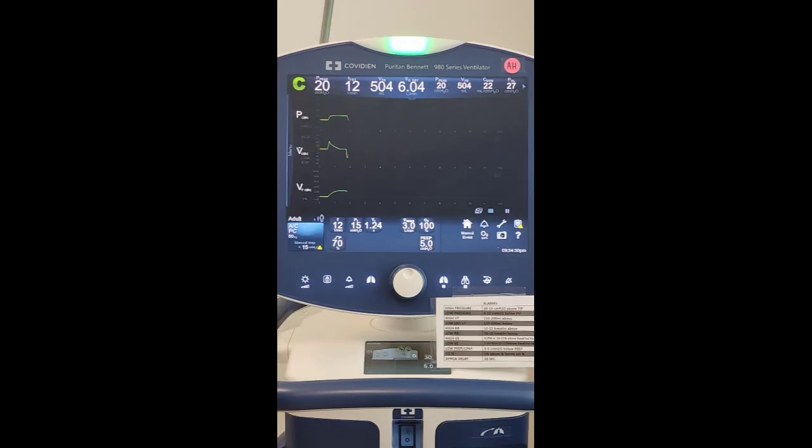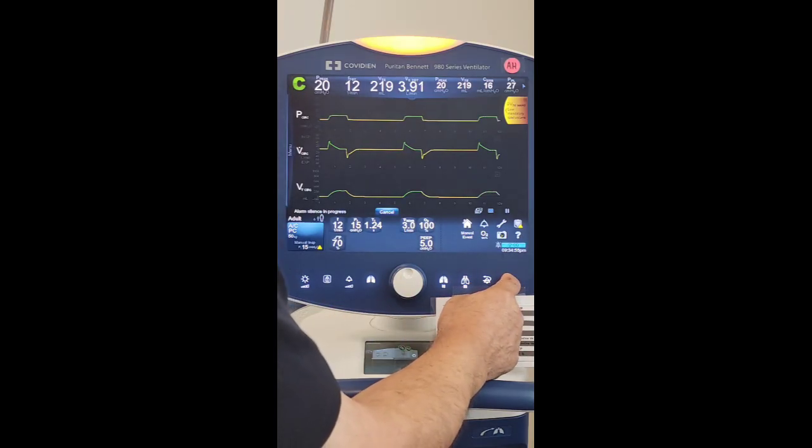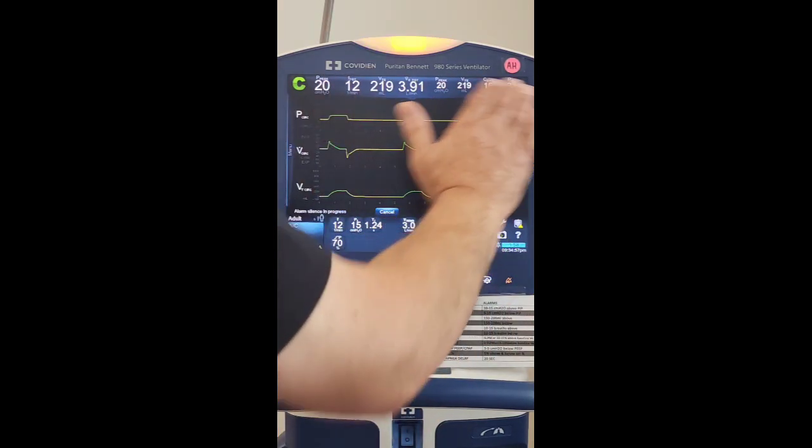So let it run a little bit here so we begin to see a few changes. Okay, so right now we got an alarm that's saying decreased minute ventilation, or actually even decreased tidal volume. So it's going to alarm a little louder probably, so I'm going to just silence it right now, and I want you to look at it.